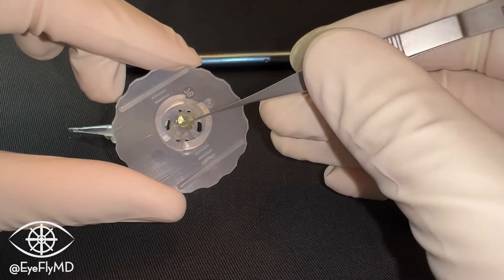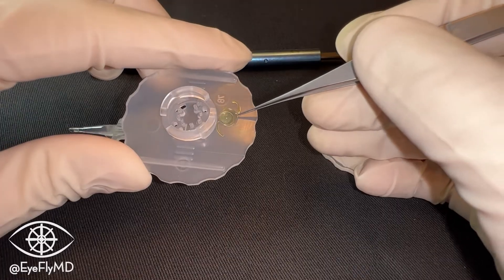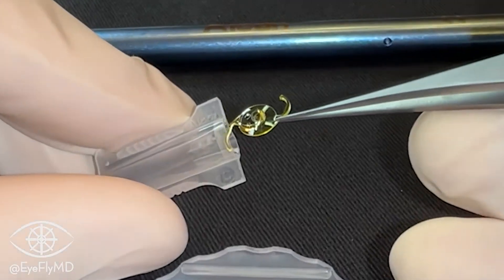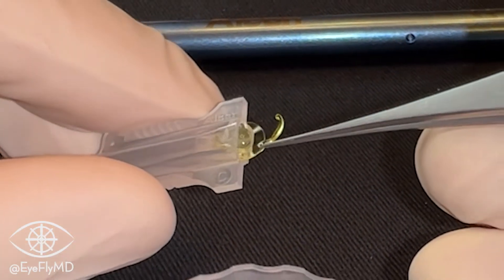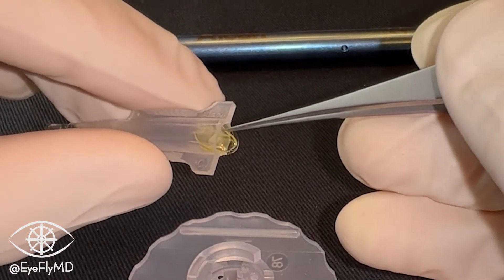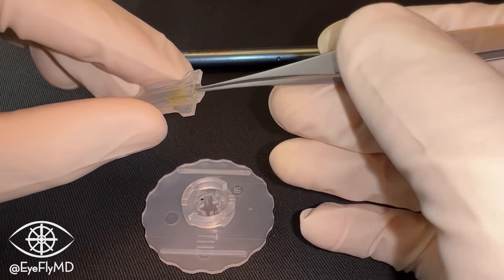Using non-toothed forceps, we'll very carefully take the IOL by the haptic-optic junction and dip the other side of the optic in the OVD we left off to the side, so now it's on both sides. Then using that tucking motion, we'll use the cartridge to tuck the leading haptic over the optic. Then we'll grab the trailing haptic with our forceps, tuck that over the optic as well, and advance the entire IOL into the cartridge.